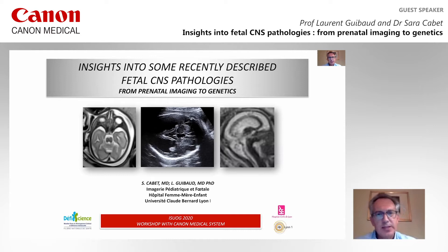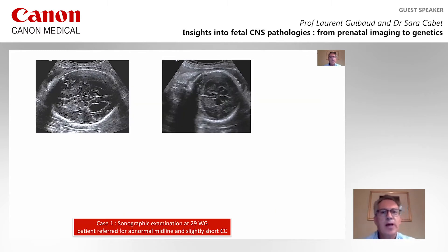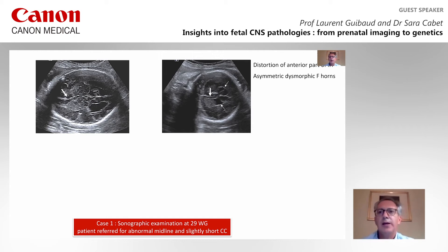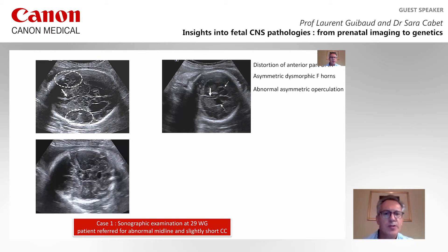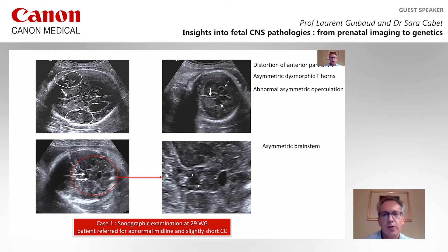The first case is a patient referred for abnormal midline and slightly short corpus callosum. On this axial and coronal view, you can appreciate the distortion of the anterior part of the interhemispheric fissure, asymmetric dysmorphic frontal horns, as well as abnormal asymmetric operculation of the Sylvian fissure. On the infratentorial structure, there is a subtle finding, which is this asymmetric brainstem.